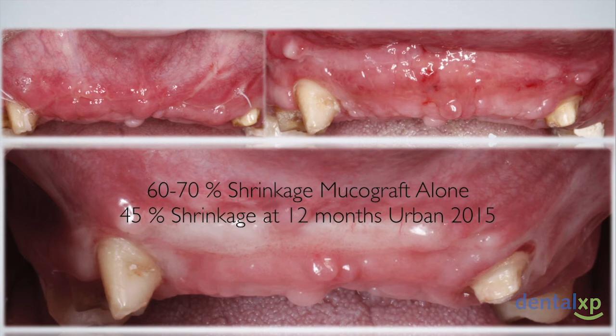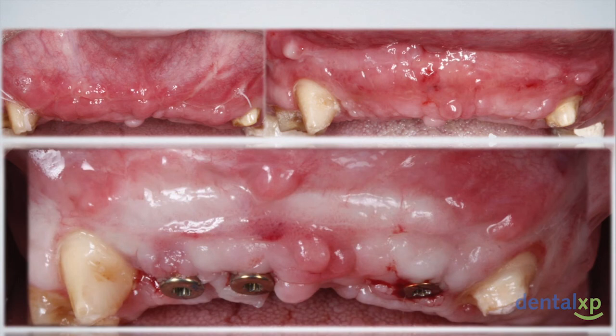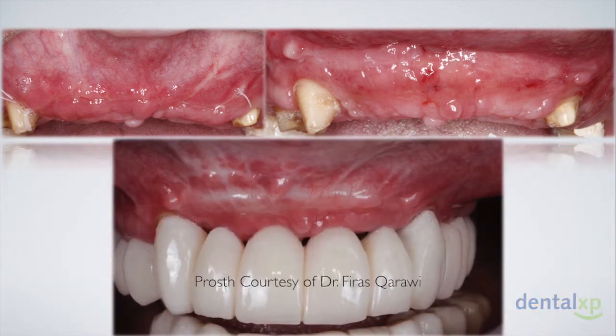Nevertheless, we were able to achieve sufficient vestibular depth, sufficient keratinized tissue around these implants, and we learned from our mistake, taking into account this anticipated amount of shrinkage, and the case was uncovered and provisionals were placed to start the soft tissue sculpting process.